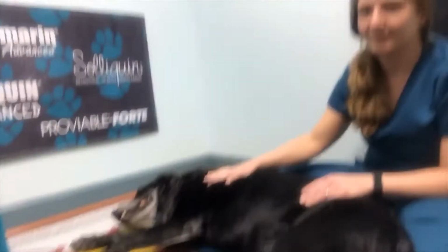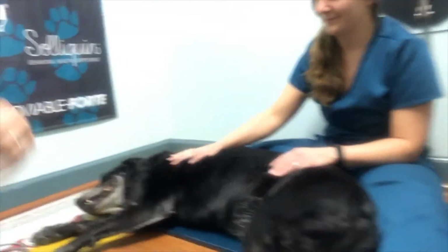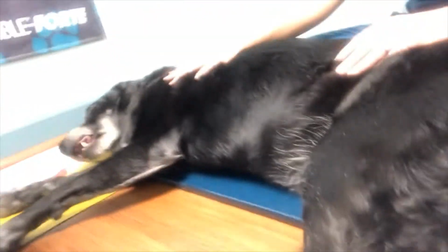So we're going to perform an EKG on Lila here. You see my helper already has her laying in right lateral recumbency. That is the proper position to perform an EKG to get proper readings.